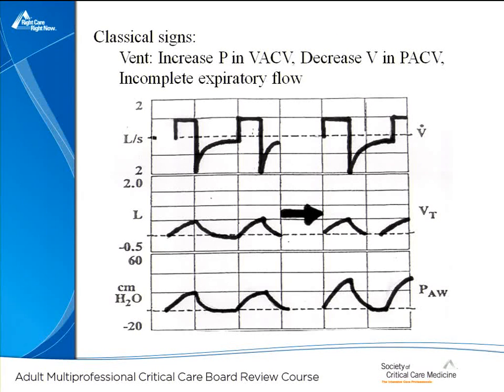Okay, so what's going on here? So let's look at these graphics. By the way, this is, again, almost assuredly due, in some variation, I think, to be on a board exam. So what we've got here is we've got flow, and the first signal here that we want to be looking at is right there. The expiratory flow has not returned to the baseline.